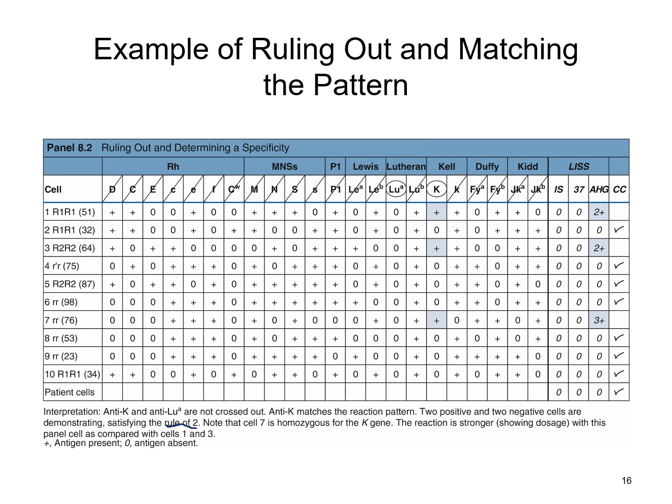You're really going to have to follow your lab, but what that means is you need 3 negative cells, so we've got 1, 2, 3, and you also need 3 positive cells. So we have 3 negative reactivities where the antigen is lacking, and we also have 3 reactivities where the antigen is present.